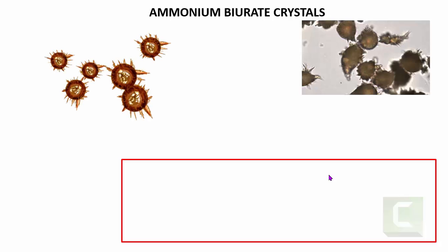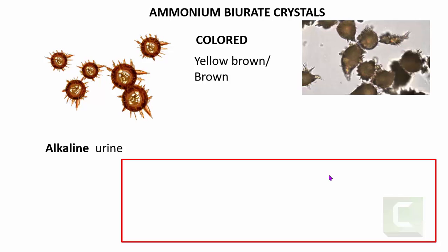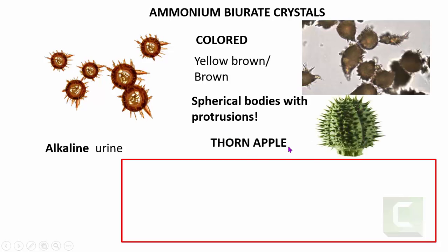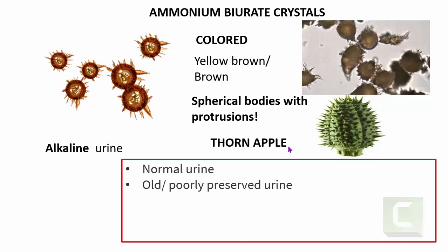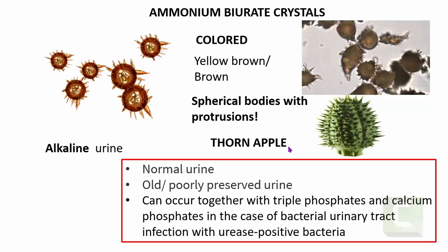The next crystals are ammonium biurate crystals — very beautiful colored crystals found in alkaline urine, yellow-brown or brown in color. Their morphology is spherical bodies with protrusions, resembling a thorn apple. Remember: thorn apple shape means ammonium biurate crystals. They can be seen in normal urine, indicating an old or poorly preserved sample. However, they can also be pathological — found together with triple phosphate and calcium phosphate in bacterial urinary tract infections, particularly with urease-positive bacteria.